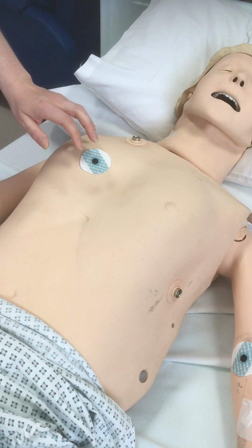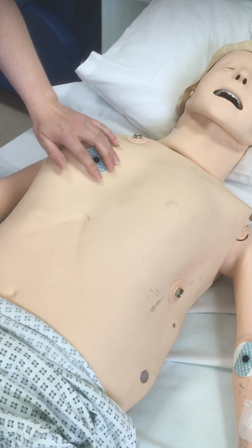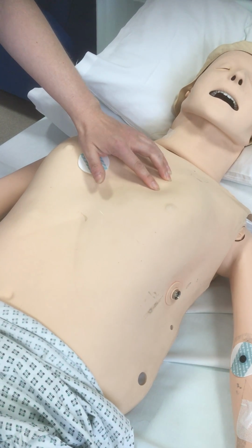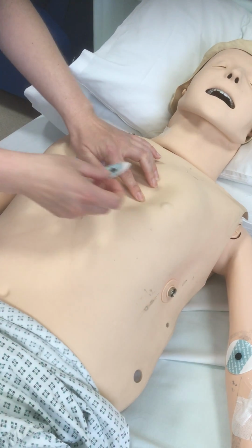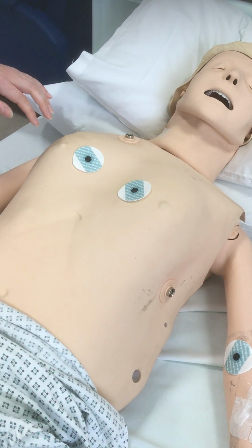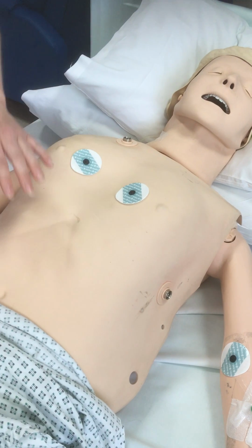V2 needs to go in the same position on the opposite side of the chest. So again, you feel across to the second intercostal space, 3 and 4, as close to the sternum as you can. We don't do V3 just yet, we do V4.